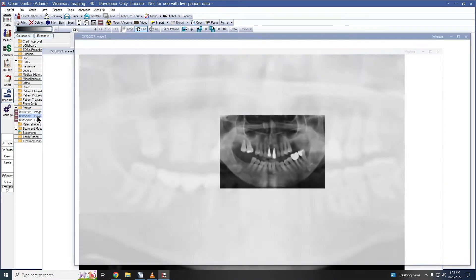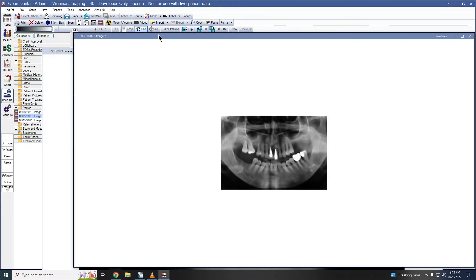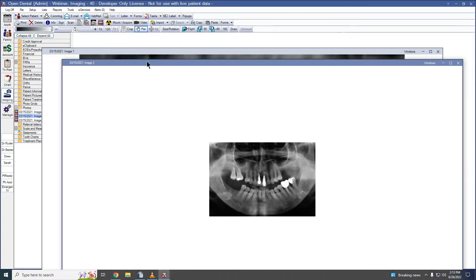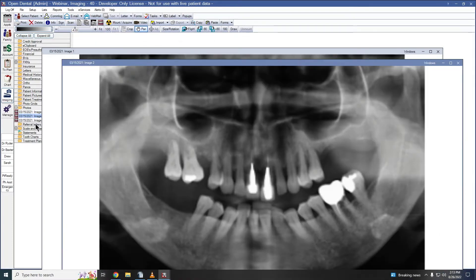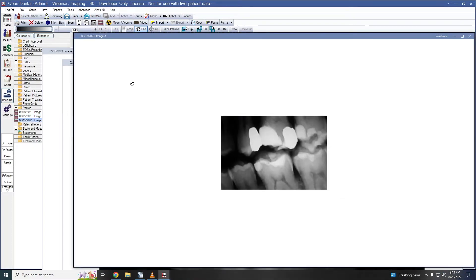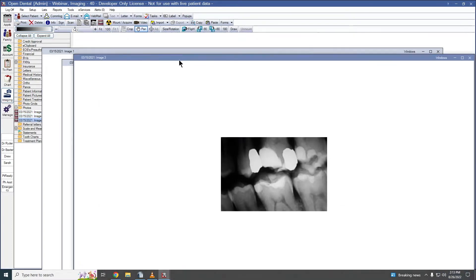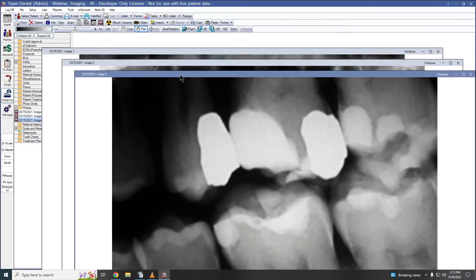Select the next image, click the title bar, and repeat the process. In this way, we can view multiple images simultaneously on the screen.